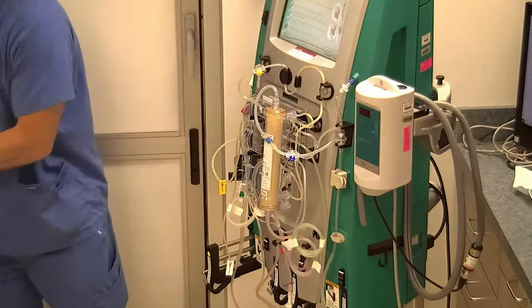Last step, it states clamp syringe line on the set. Typically the reason why we're clamping this, remember we're not using our anticoagulation, we're not using our syringe pump for our heparin if we were to use it. So we're just going to go ahead and clamp it because we're not going to use it. Now just for future reference, if there was an order to instill heparin into the machine for a patient that is severely clotting, you can utilize this line, but you would run your heparin on an external IV pump. According to the physician orders, you would open this syringe line, open it, and then connect your heparin here. But for now, we're just going to keep it locked, clamped off.